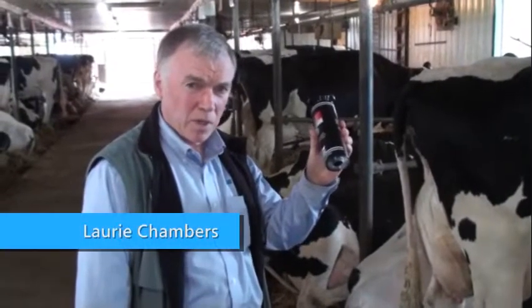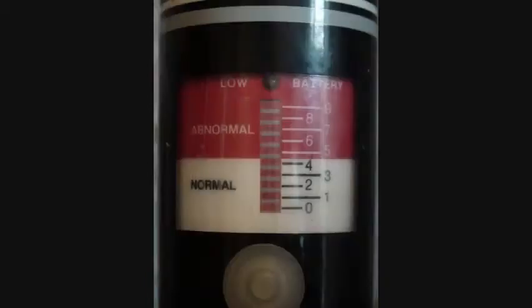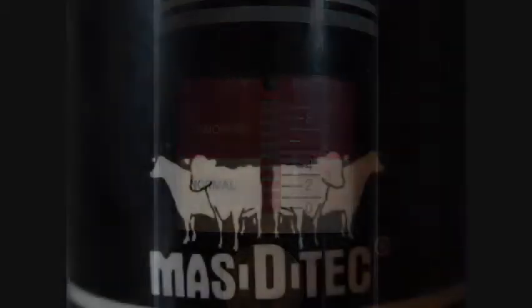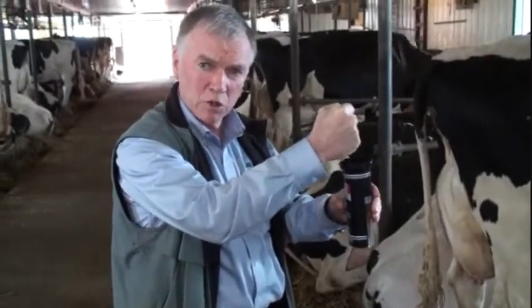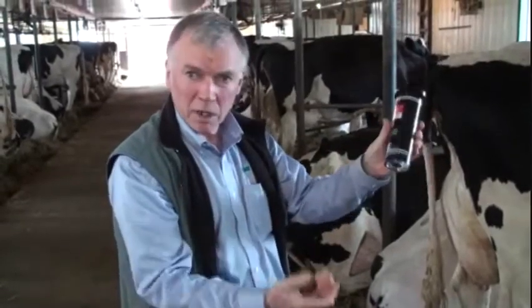Here we have a Mastatec, and this instrument is what we use to test cows for subclinical mastitis. This tool is very simple to use — it's a matter of a quarter teaspoon of milk in the top part of the instrument, milk runs out the bottom, pinch this button and we get a readout.